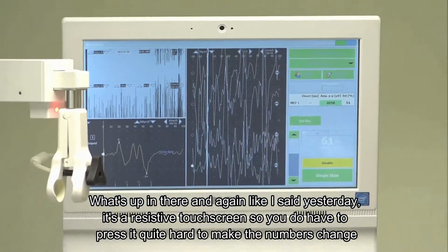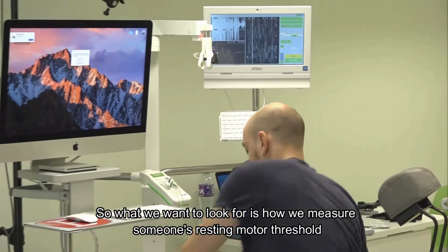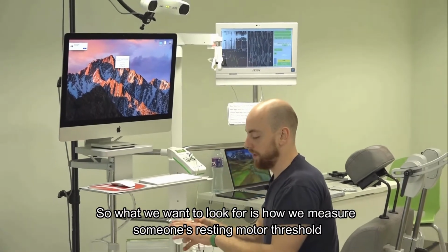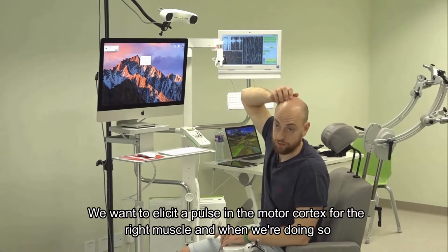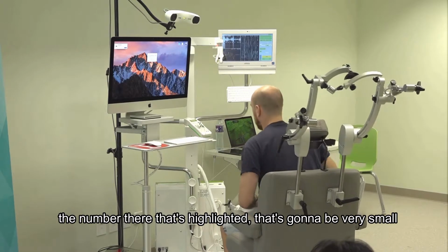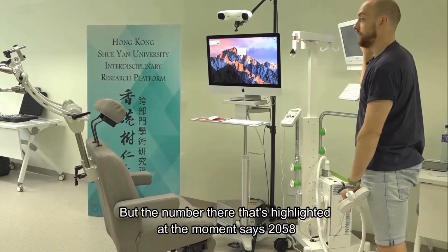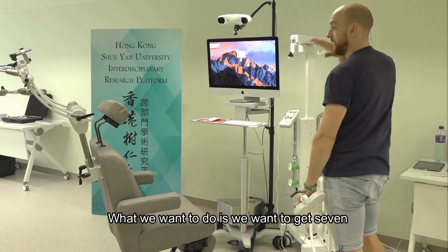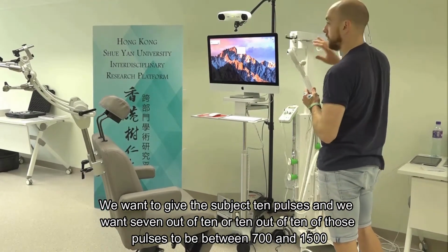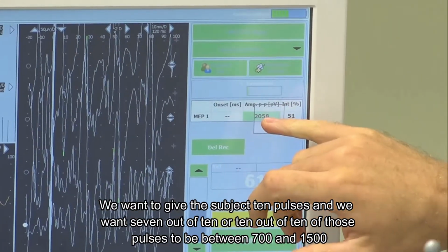Okay, so what we want to look for is how we measure someone's resting motor threshold. We want to elicit a pulse in the motor cortex for the right muscle, and when we're doing so, the number that's highlighted, now it's going to be very small so I do apologize, says 2058. We want to give the subject 10 pulses, and we want 7 out of 10 or 10 out of 10 of those pulses to be between 700 and 1,500.